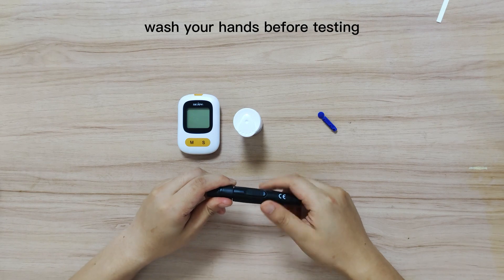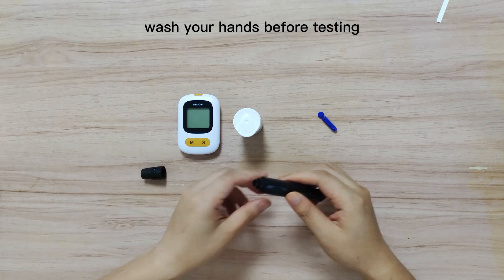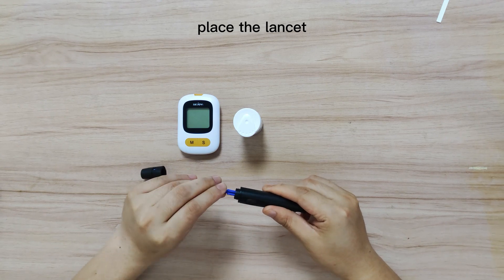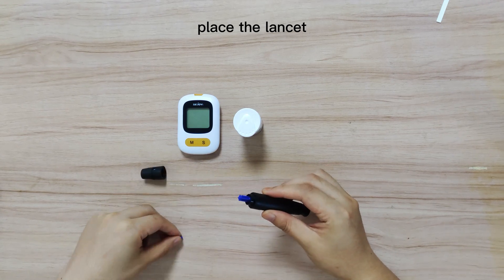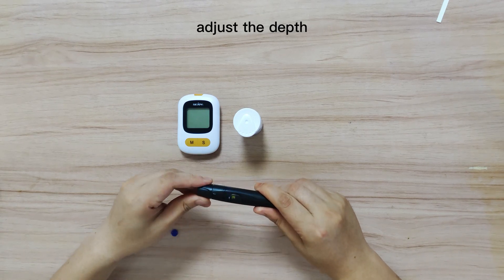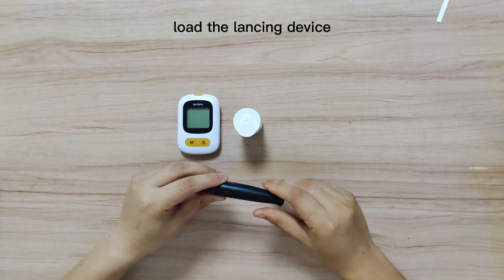Wash your hands properly before testing and wait until they are dry. Put the sterile lancet into the lancing device. Adjust the depth of the lancing. Load the lancing device.